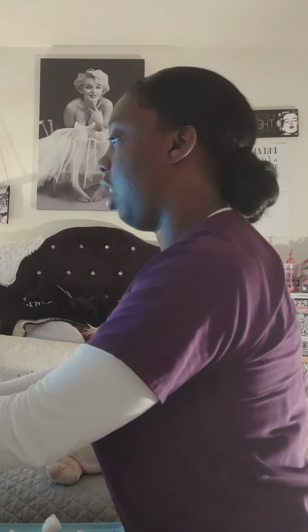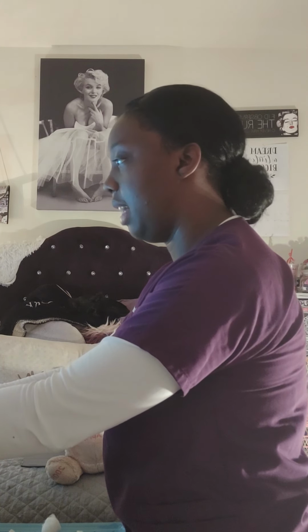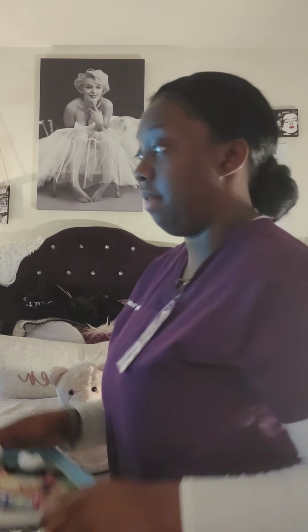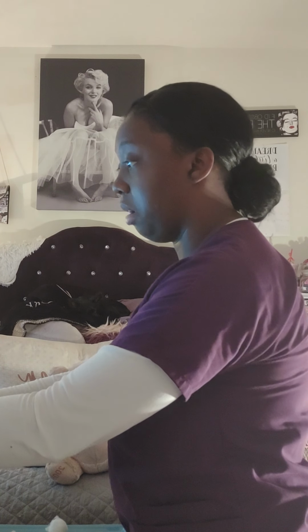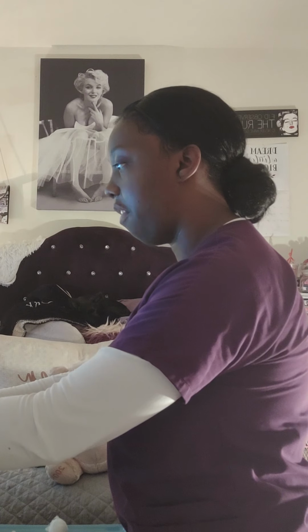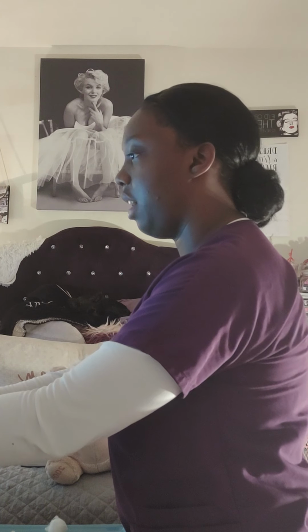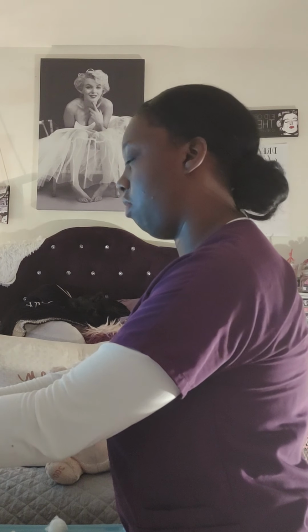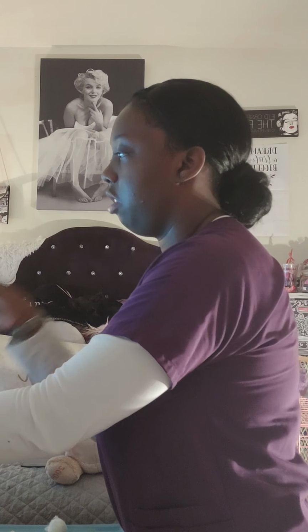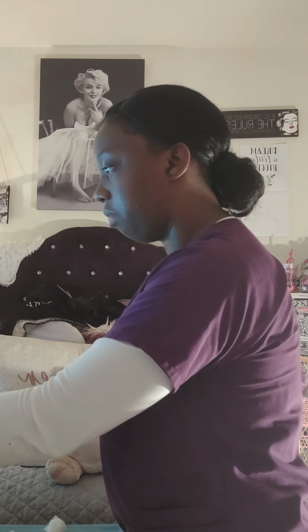Alright, so the next injection we're going to do is a second intramuscular injection, but this one is going to be in the vastus lateralis. Again, I have my medications near the bedside. I'm going to access my patient's MAR, or her medical record. Have her verify her name and birthday for me. Sally George, birthday April 1st, 1995. Looking at her medical record, she's going to be getting an influenza virus vaccine, 0.5 milliliters, IM. The frequency is once, and the time to be administered is prior to discharge.